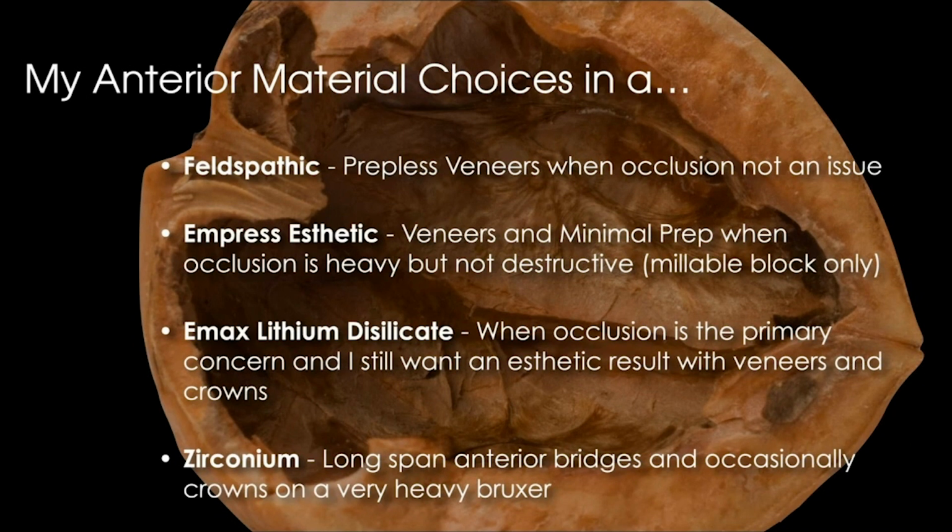I'm not a big zirconia crown person because I like to bond my crowns in. Of all the materials in the posterior, I use e.max more than zirconium. And if I had to use a zirconium crown, it's where the person is destroying e.max, or they've got a very heavy occlusion.